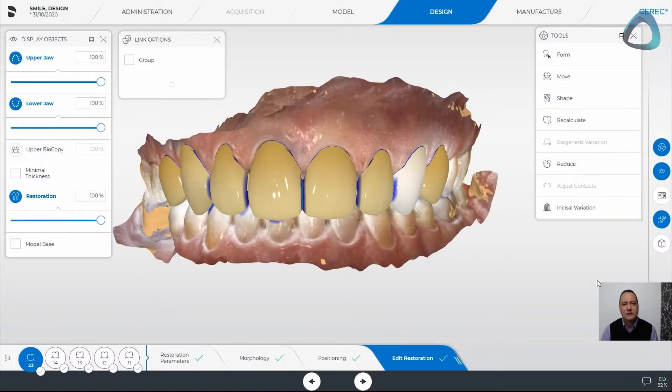The photo that we need is a high-resolution JPEG image, pretty much like a passport photo. We want neck and above, face, nice close-up, with the patient smiling so you can visibly see the smile of the patient sitting naturally.